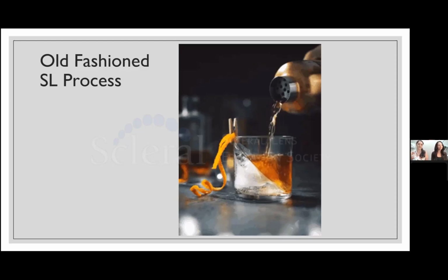So the first thing that you can kind of decide, whether you're just starting out with scleral lenses, or whether you're in a business that has a lot of support, a lot of technicians to help you, certainly, following the fitting guide is the biggest thing. We want to take a look at your HVID, determine the best diameter, and then you're going to determine the best fitting guide. Now, some people you can actually have your technicians learn that. So they can start looking at your topographies. They can start looking at your HVID and actually say, you know what, we're going to put this lens in based on the fitting guide. I'm going to start them here. And then your technician can do all the work for you.